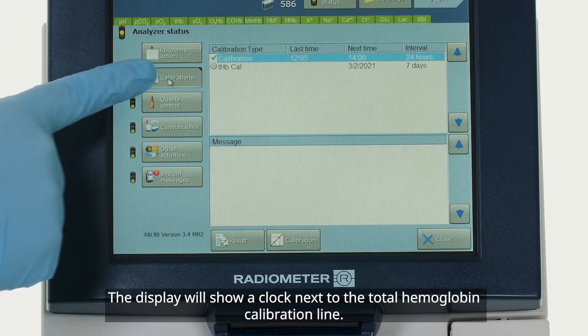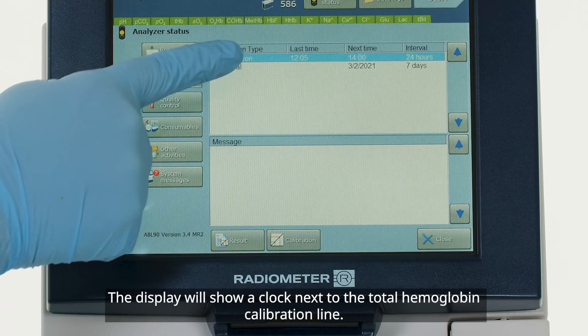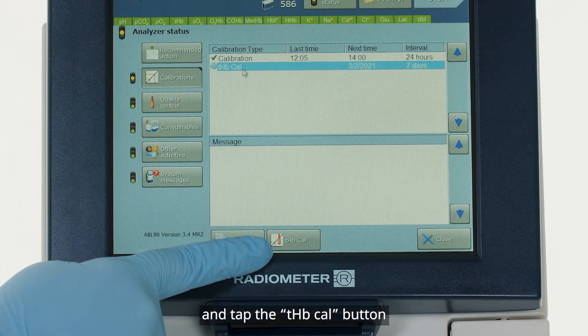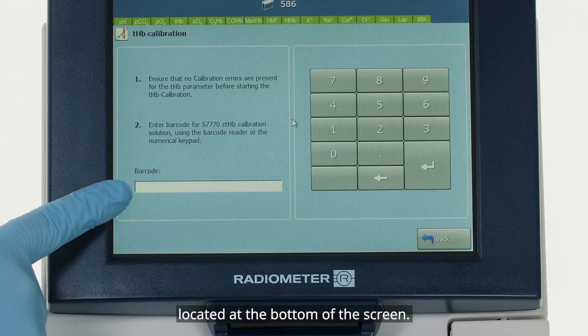The display will show a clock next to the total hemoglobin calibration line. Highlight the total hemoglobin calibration line and tap the THB cal button located at the bottom of the screen.